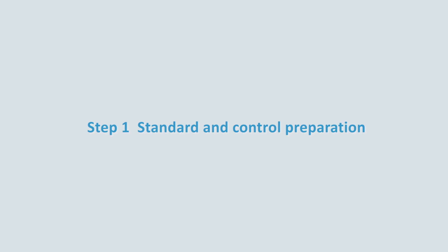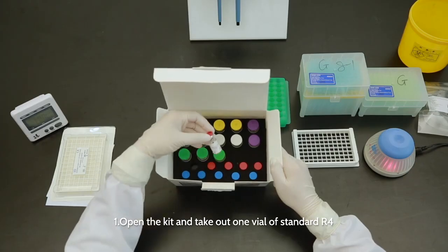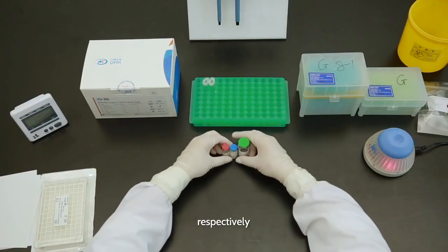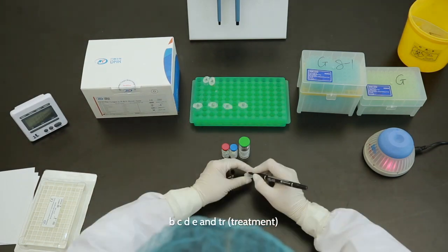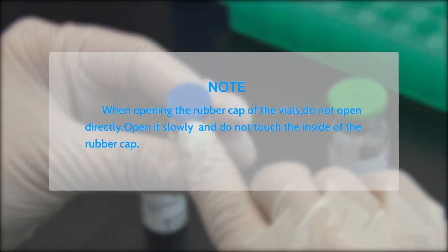Step 1. Standard and control preparation. 1. Open the kit and take out one vial of standard R4, control R5, and dilute R6, respectively. 2. Take out 5 glucan-free transfer tubes and label with B, C, D, E, and TR. Note: when opening the rubber cap of the vials, do not open directly. Open it slowly and do not touch the inside of the rubber cap.